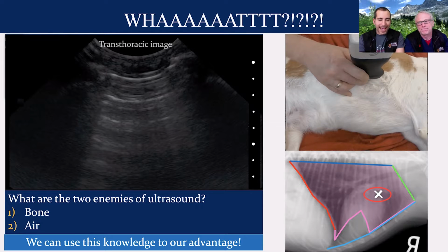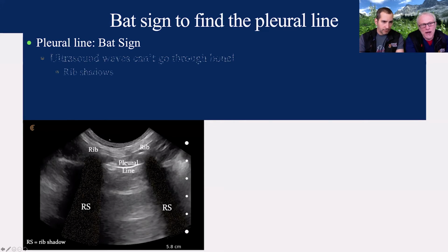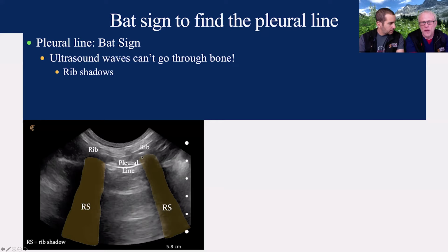Okay, so we talk about pattern recognition, Dr. Boysen, because that's one of the reasons why I want to put the probe perpendicular to the ribs. What are we trying to find? When we put the probe on, Dr. Chalhoub, let's break this down. We put the probe on at the skin interface here, and the ultrasound beam comes down and hits bone, Dr. Chalhoub. That creates artifacts. So we get this rib shadow because that is one enemy. The probe's here, it goes through the skin and soft tissues, hits the bone, and makes a down white curvilinear structure. We're going to talk about the bat sign. That is the wing of the bat, Dr. Chalhoub. So ultrasound hits bone. We only see rib shadow and artifact below the bone, which we're going to call the wings of the bat. This will make sense in a second.